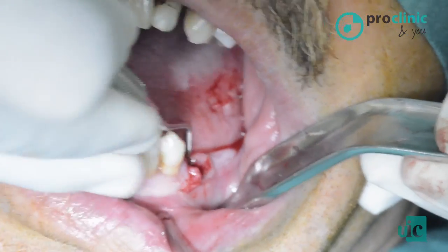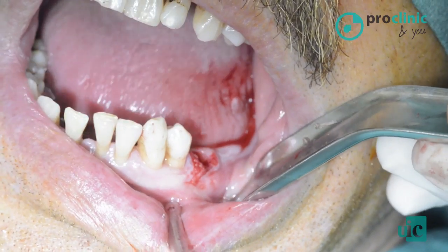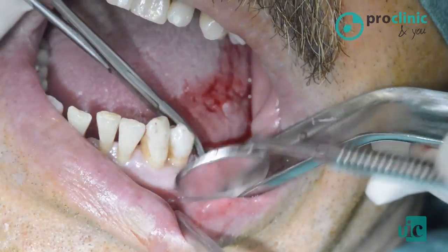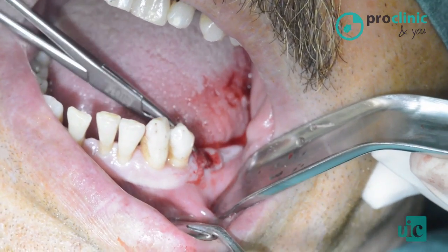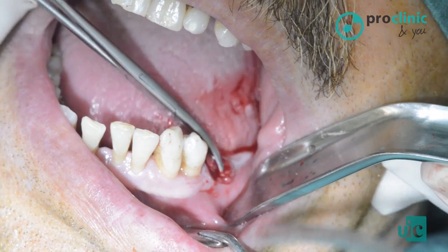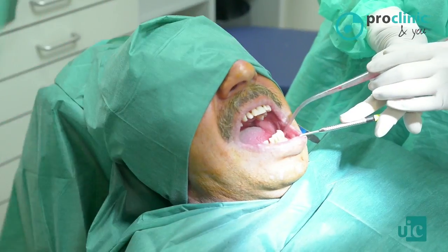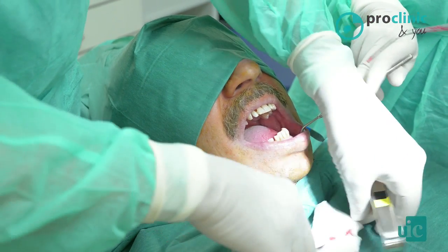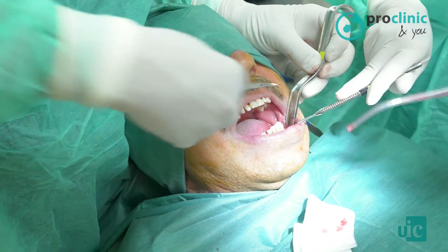With the curette we should feel that we are scraping the inner part of the alveolus, the bone, and we should finish the soft tissue removal with a mosquito. With a hemostatic forceps or a mosquito, if you like. Pull.